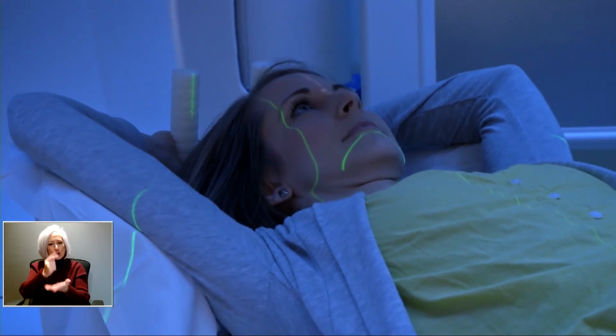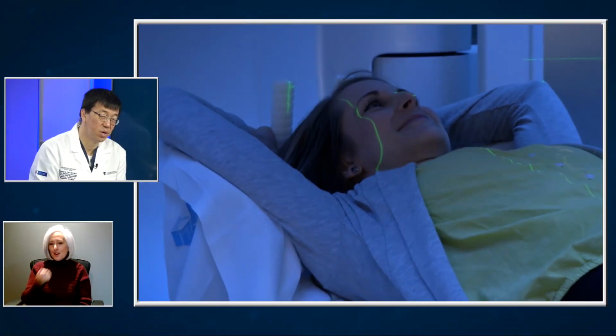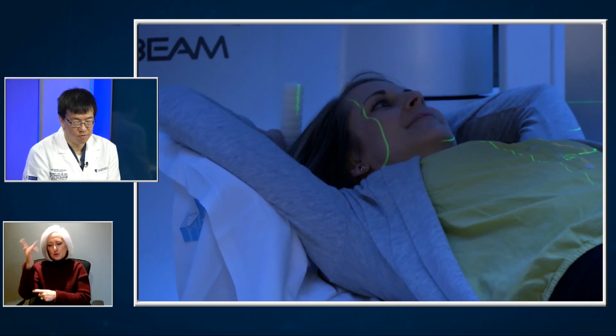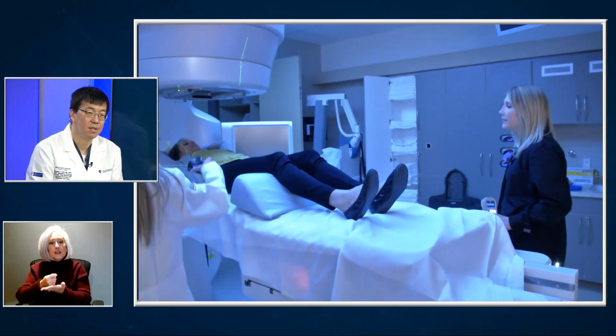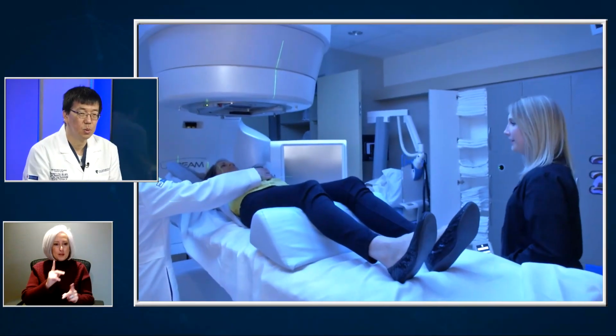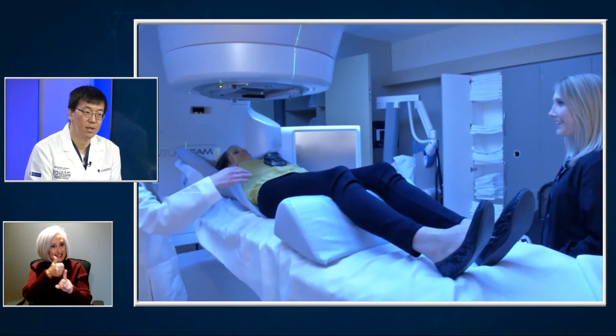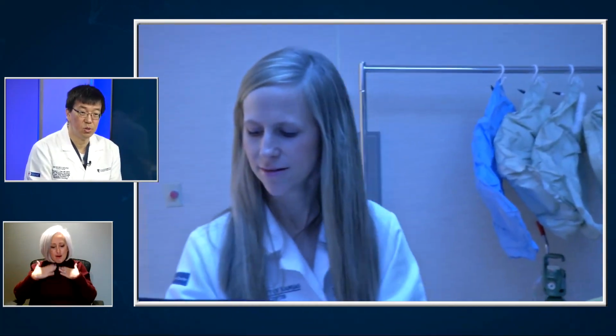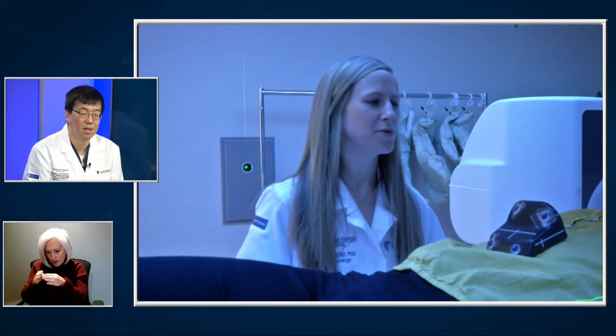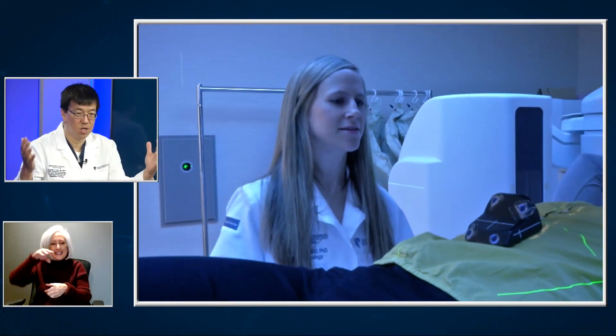I think there's a couple of really important aspects of brachytherapy, for patients like Bob and other patients. I think one aspect of giving radiation is we want to give the highest amount of radiation to where the cancer is and minimize the radiation to other organs outside of that tumor. And actually, the best way to do that is by putting the radiation directly into the tumor, like brachytherapy. And there's no external machine that can do as much as we can with brachytherapy.